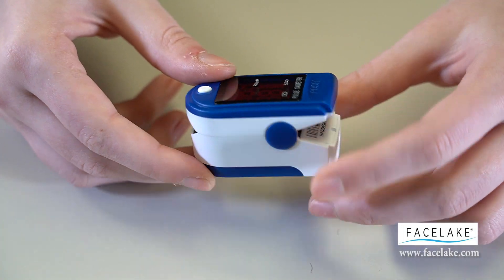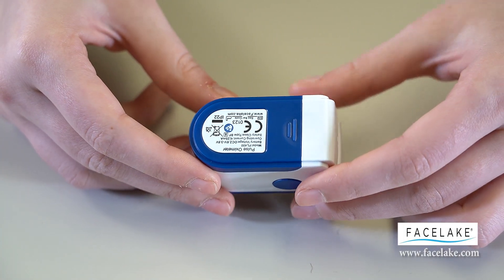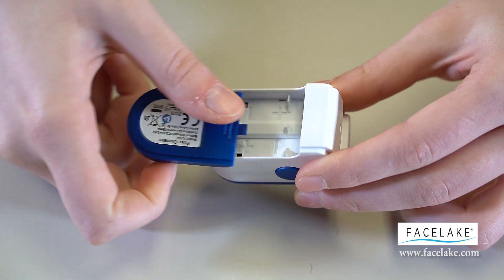The batteries will face opposite sides as per the plus and minus signs. Please insert as so.